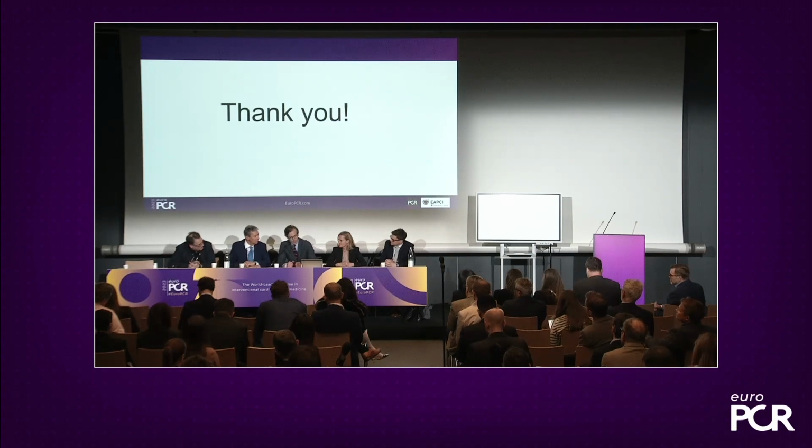Yeah, very important question, Fabien. Thank you. I think let everybody else judge. We had TEER on the mitral, TEER on the tricuspid, and the cardioband, and both of you guys had beautiful results for TEER without using a TOE probe. So I think spatial resolution is actually quite decent.